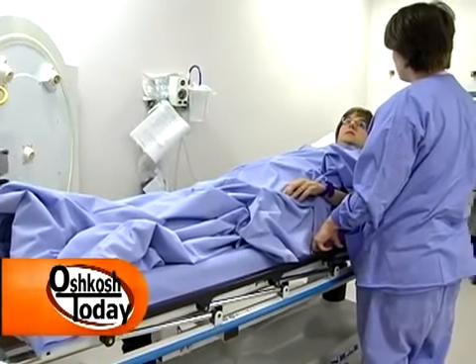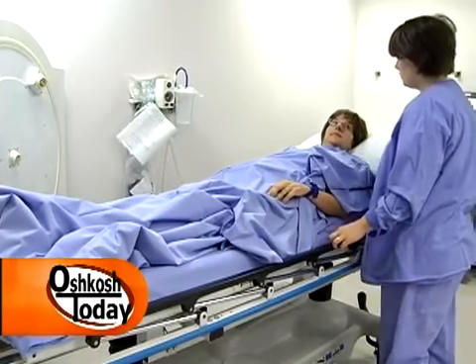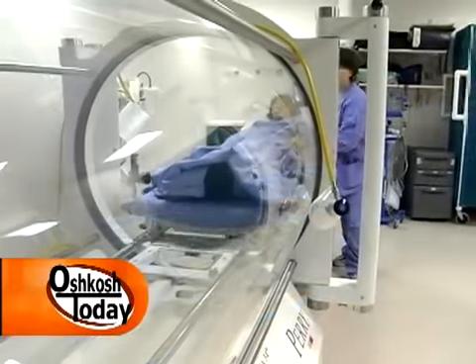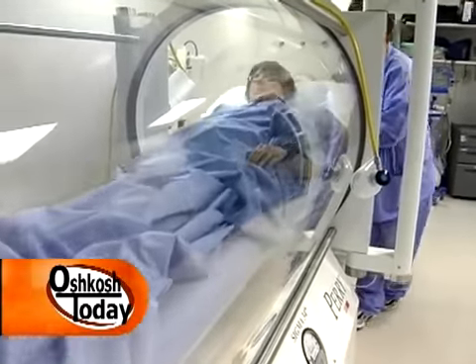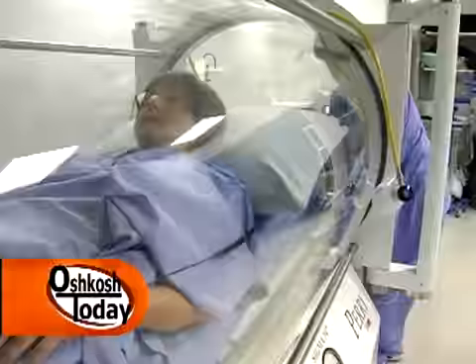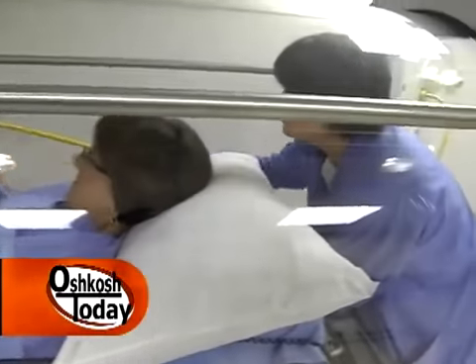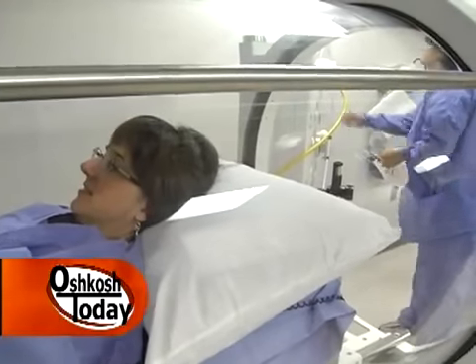Okay, well, when you're getting ready for this, how long is a typical treatment? How long are you going to be in a unit like this? Treatment takes about 2 hours. There are varying therapies for different diseases. Necrotizing fasciitis, or the flesh-eating disease, usually gets a longer treatment, and more of them in the first 24 hours and at a higher pressure. Usually that goes to 2.4 to 3 atmospheres of pressure. We usually do 2 atmospheres in this chamber.